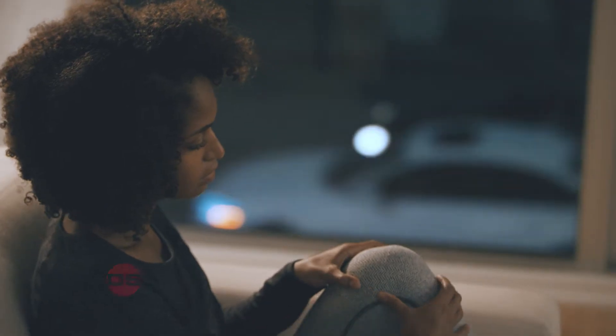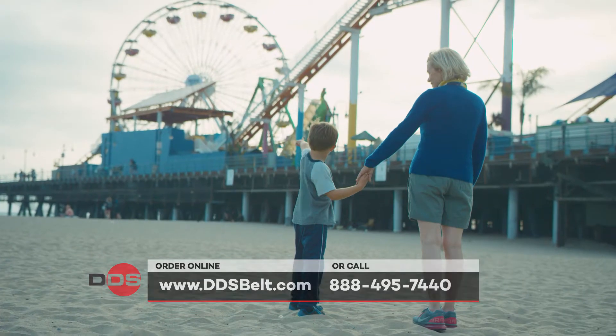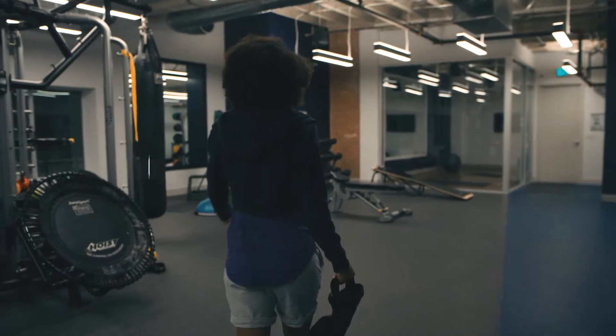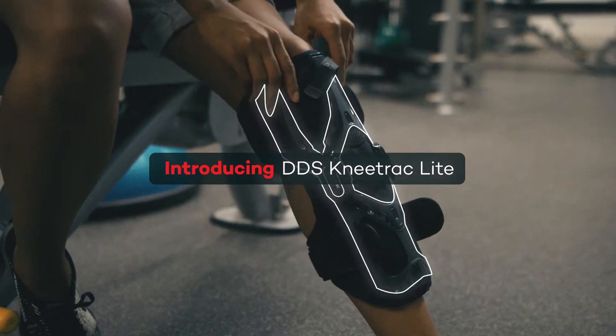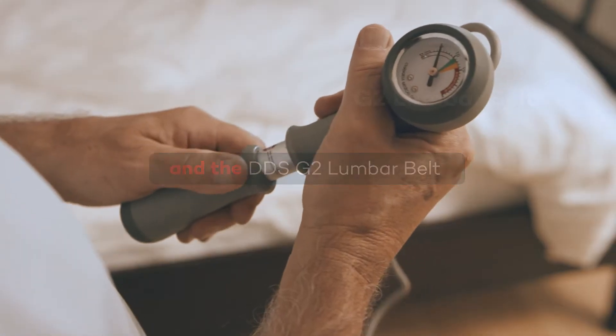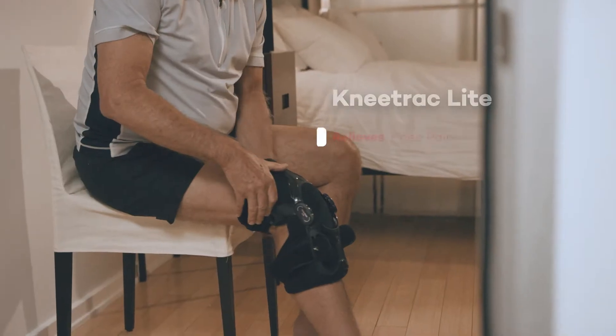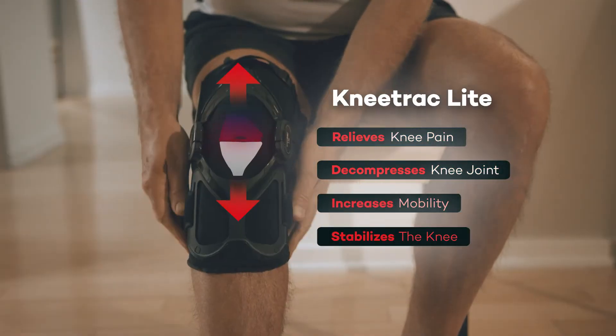People think that physical challenges like knee and back pain can be debilitating and deny you a healthy life. It can be. But they don't know that a simple brace such as the DDS Knee Track Lite and the G2 Lumbar Belt can provide maximum comfort and support through decompression, reducing the pressure and pain on the lower back and on the knee joints.